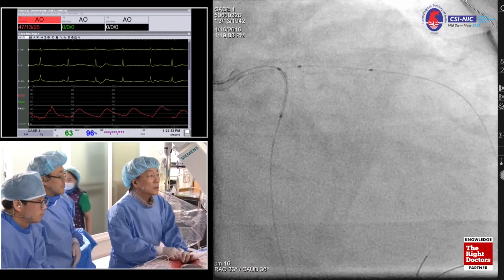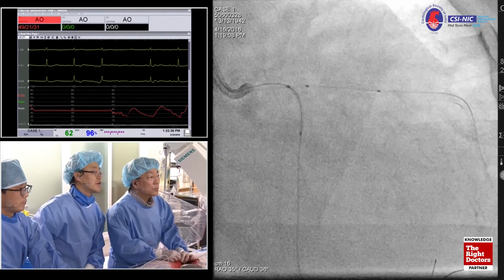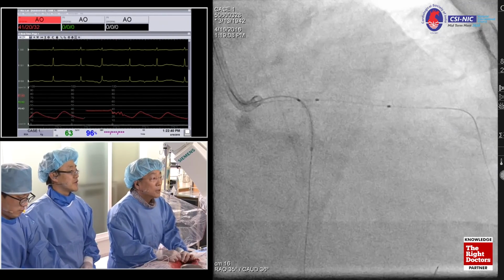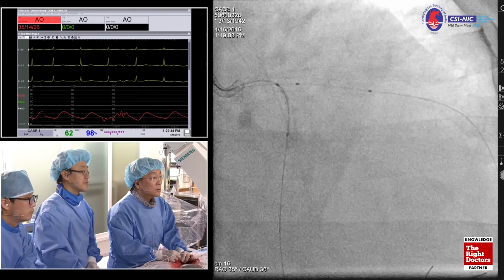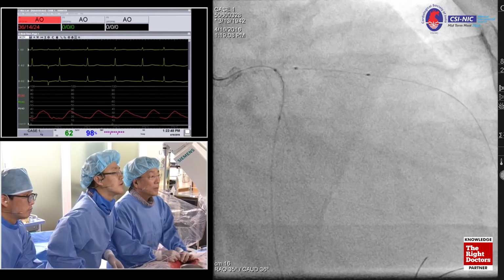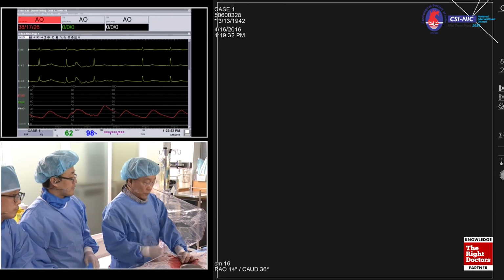All right, test please. Yes, you can clearly see that the proximal part of the stent is protruded. The main vessel is hanging out a little bit, right? I think it's 3.5. Spiral view again. 3.5 is okay.